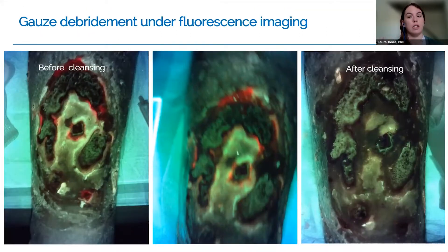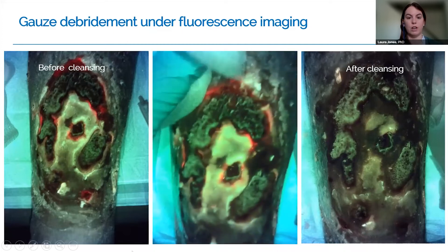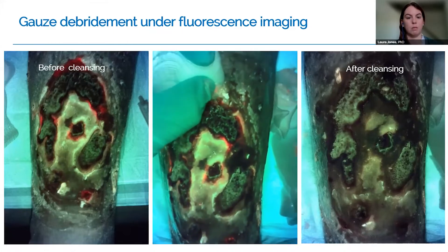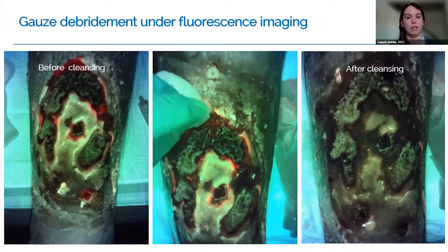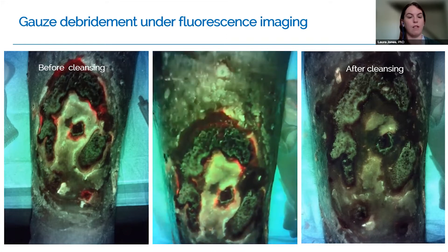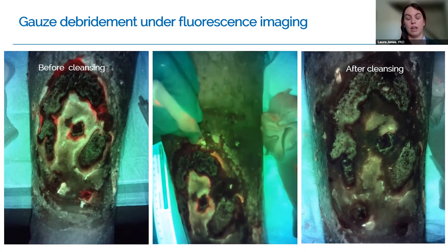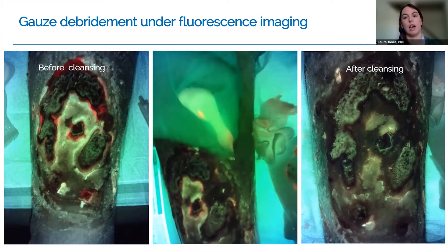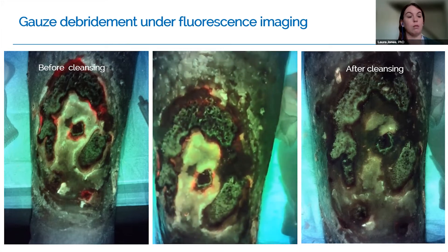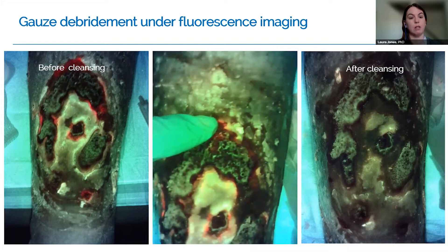This can have implications in cleaning and debridement. Before cleaning, you can see the red fluorescence around the edges. And if you watch this video in real time, the clinician is coming in with some gauze, cleaning away that red fluorescence, and you can see it coming off directly as she goes. In real time, you really have that feedback of how the cleansing is progressing. And in the image to the far right, after cleansing, she was able to remove all of those areas of red fluorescence, decreasing the bacterial load.